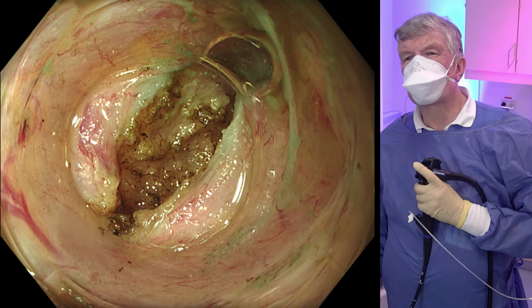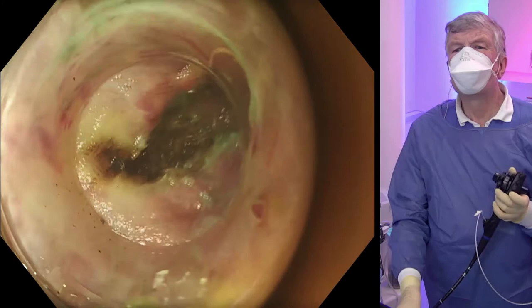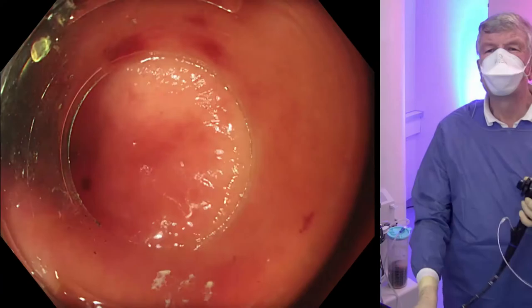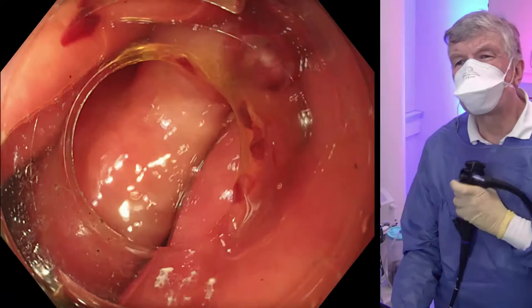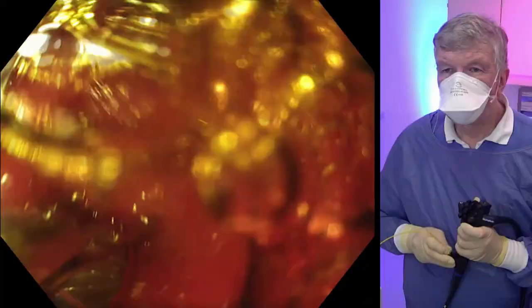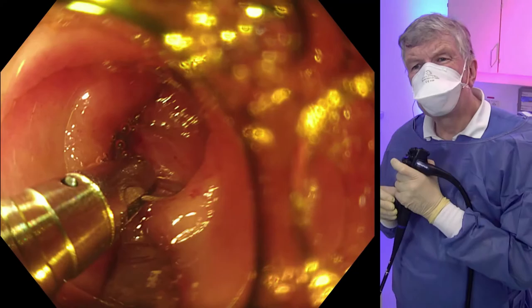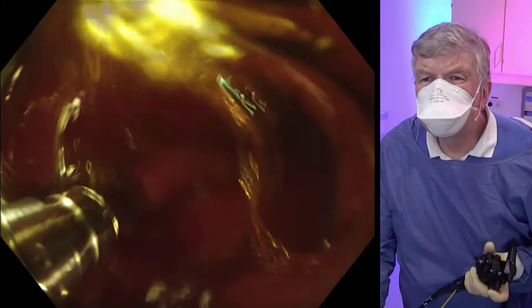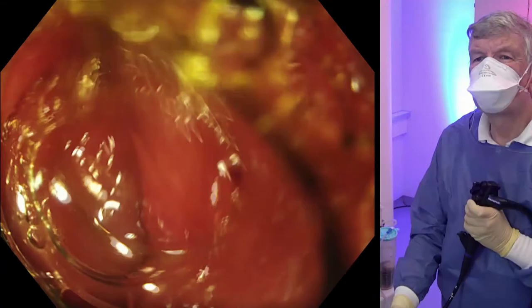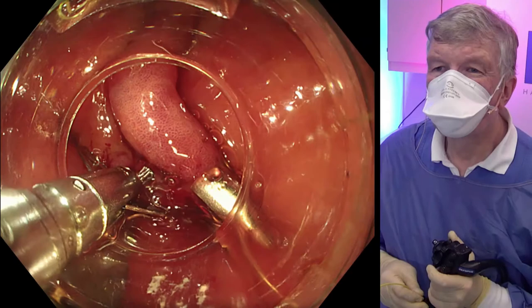Here you see the final result of the sphincter cutting. The muscle is cut. We pull back through the channel. What we do next is closure of the entry site using large clips. Due to a different angle, this is a little bit different. Here you see the pylorus, which seems to open more widely, but this is not to be assessed by endoscopy. Here we open the clip at the proximal margin and shoot the clip when we have the impression it's in a good position. We continue step by step with further clips, adapting the mucosal margins.